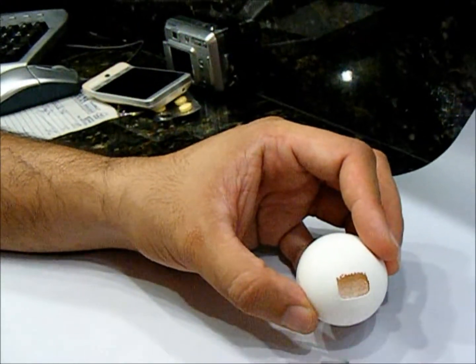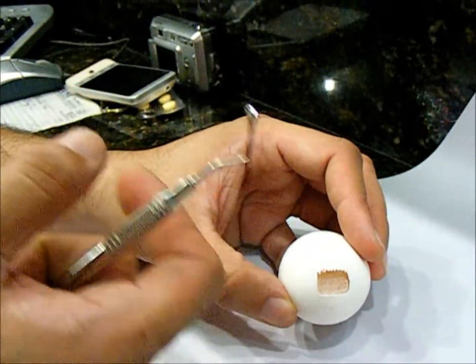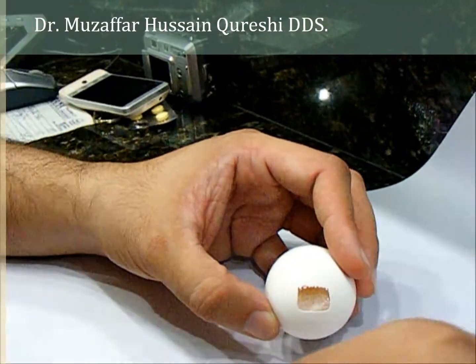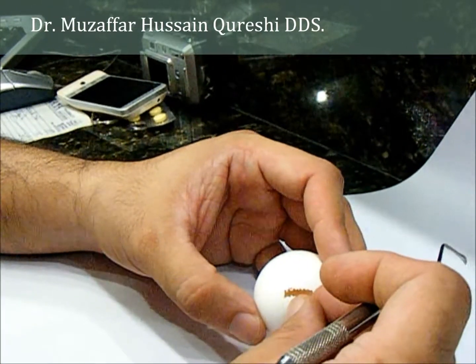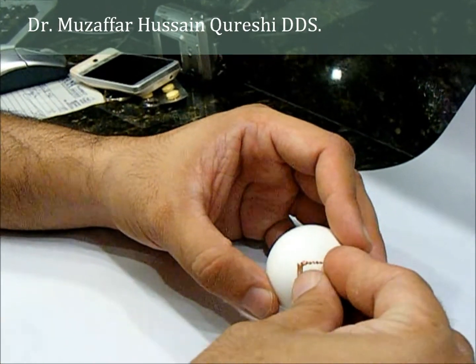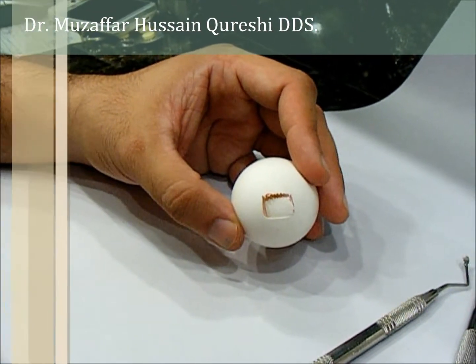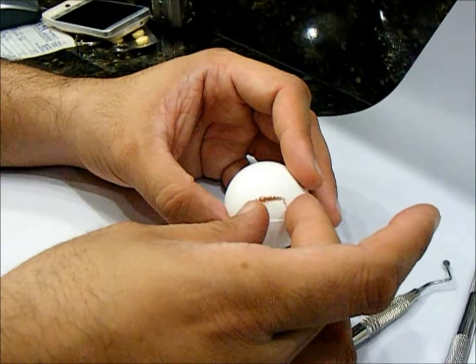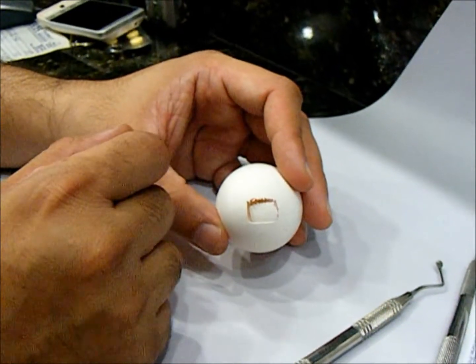You take that coagulum along with the bone and start packing it. Fill your syringe and then disperse the whole syringe — remember, no quick movements; slow and steady you can do anything. Once you have packed the bone inside and are done, the bony window that you have kept nicely saturated with the patient's own blood and some glucose for nutrition can be placed back up on top. Once placed back, you can cover it with a separating membrane if you like. Otherwise, the condensed allograftic bone on the inside will support the window of bone. You go ahead and stitch it all up, and you have a nice sinus lift.